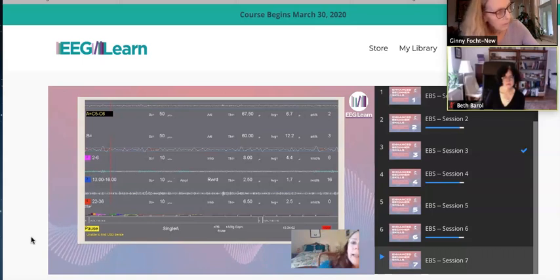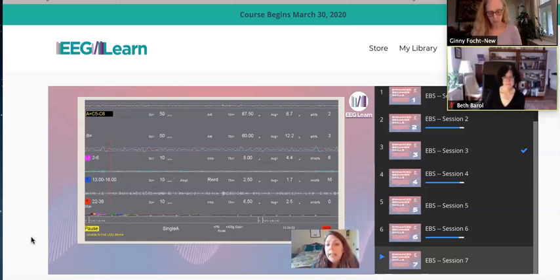But this is why with someone like this, I tell people if that activity is coming up at all, that's great. That's cause for celebration. The only way I know how to coach people to do that, if I'm rewarding in the 13 to 16 hertz range, which is hopefully this person's low beta range, and low beta goes along with a calm external focus, is this.